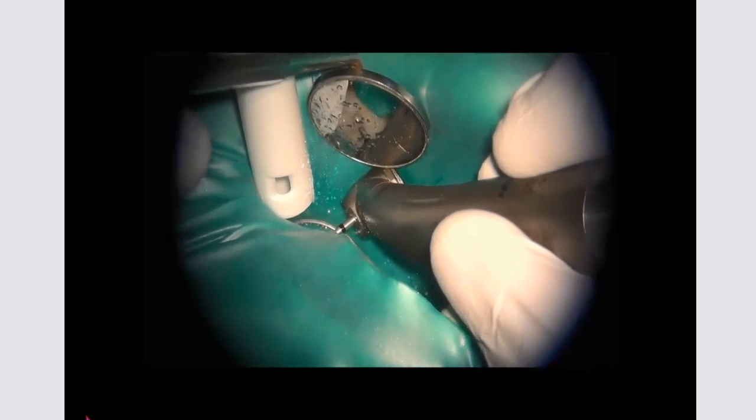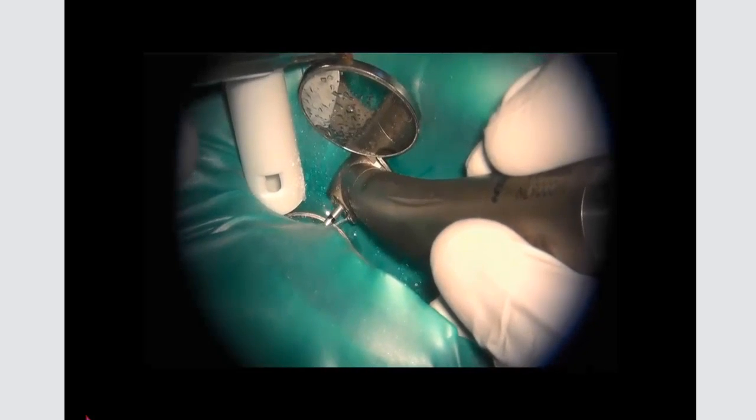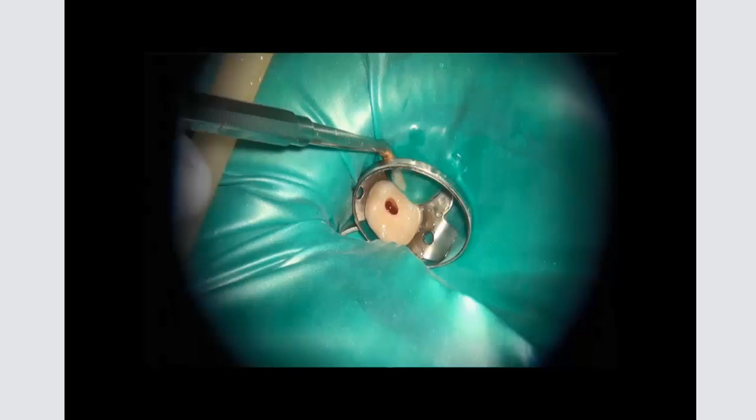One thing I'm finding with the zirconia and lithium disilicate crowns on the market is it's putting a lot more stress and strain on handpieces. And so my turbines are wearing out, my burrs are wearing out. Well, the burrs are single use, but the fine diamonds seem to do a little better job with getting through these materials.